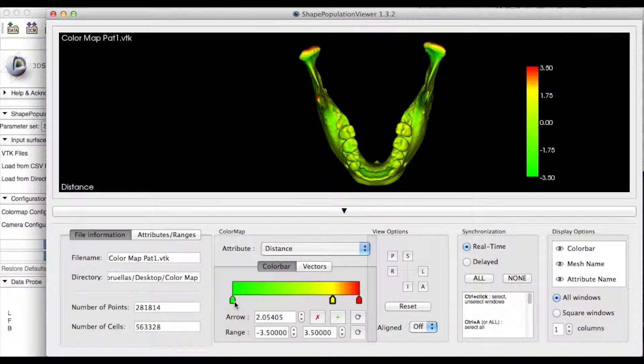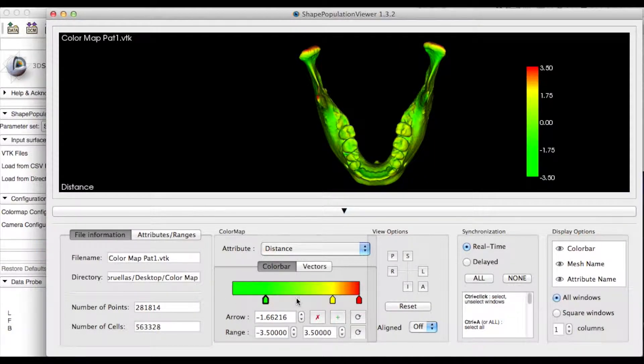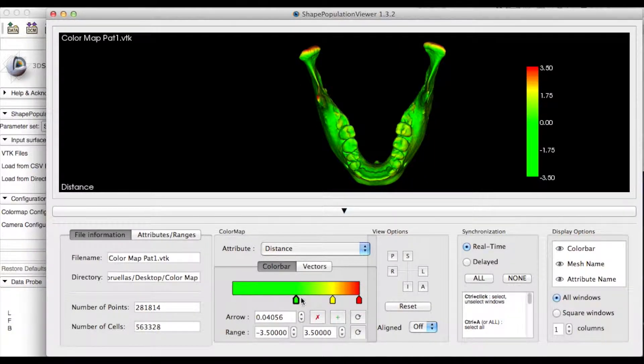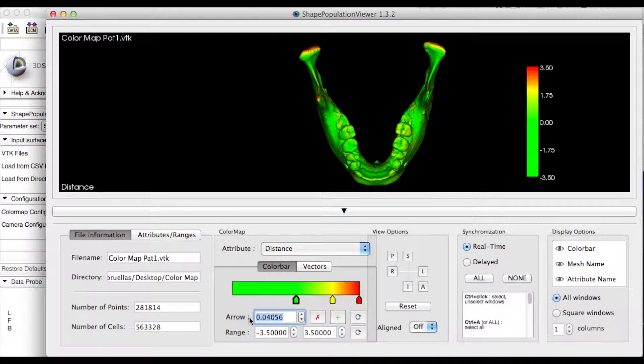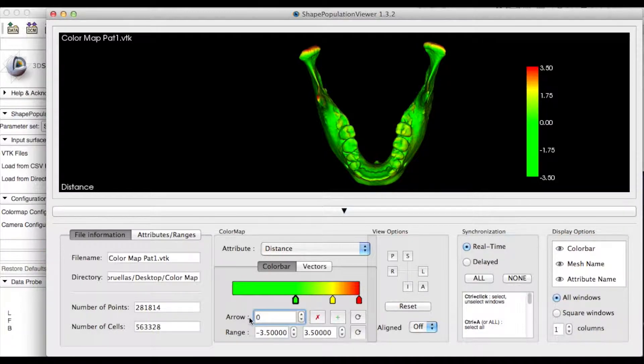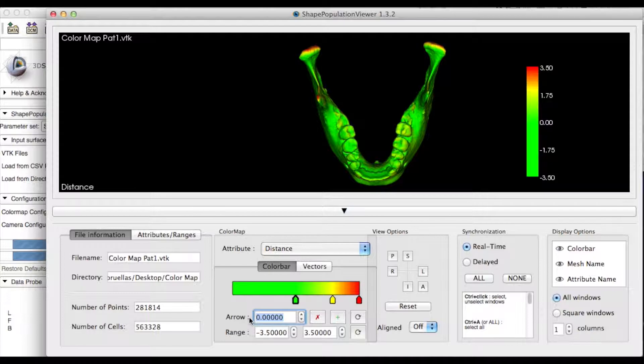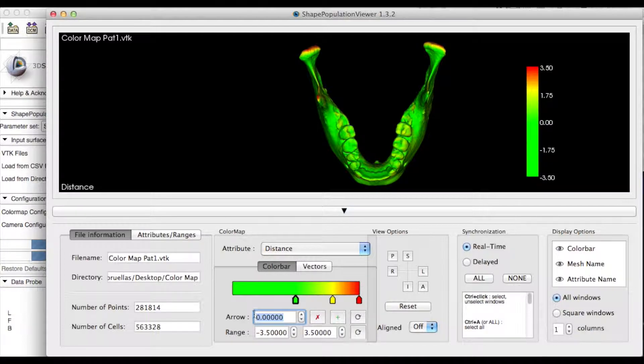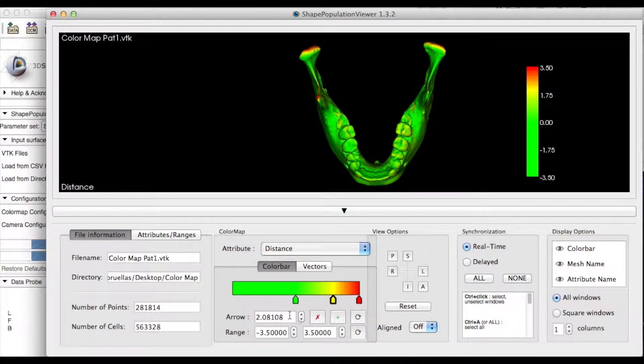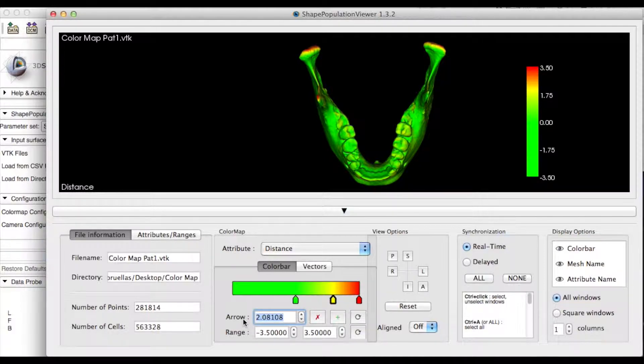If you set the green arrow at zero, it'll show little or no change between T1 and T2 models. The red side of the spectrum displays surfaces with outward change, also known as a positive value of mean surface distance between T1 and T2 models. We set yellow as a midpoint at 1.75 millimeters.